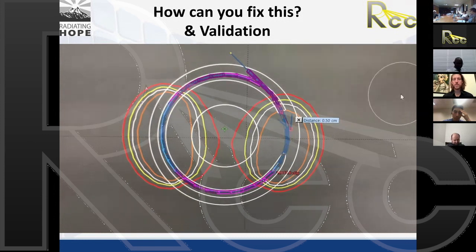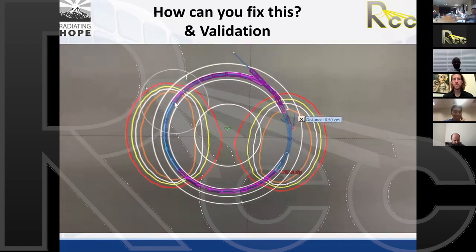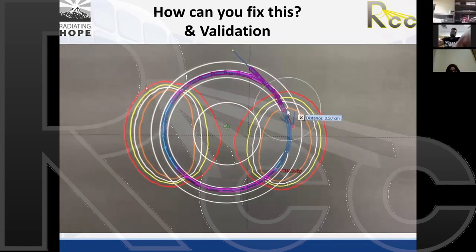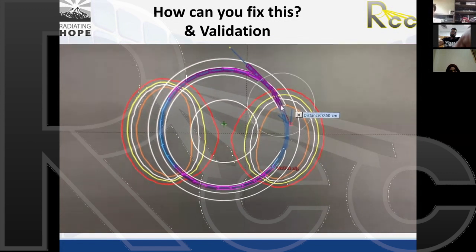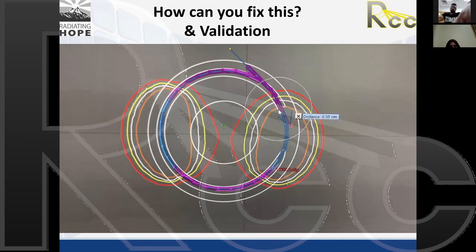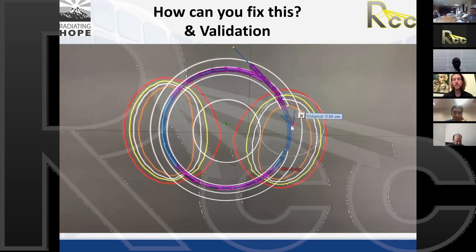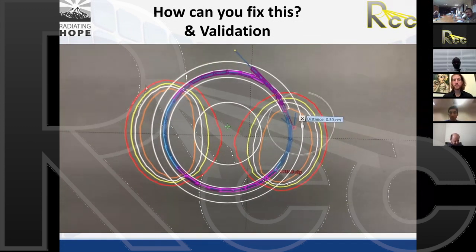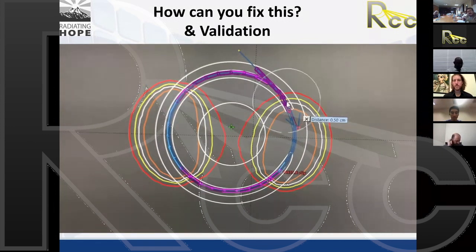These are the actual delivery positions, which will in turn show up correctly on your planning system because we've planned with our first reconstruction point shifted past the internal lumen by the amount that we discovered in commissioning. And this amount is the difference between the measured dwell positions and the actual dwell positions in the TPS. So by this method, if you reconstruct here, then what you deliver shows up the same as what you do on your treatment planning system.